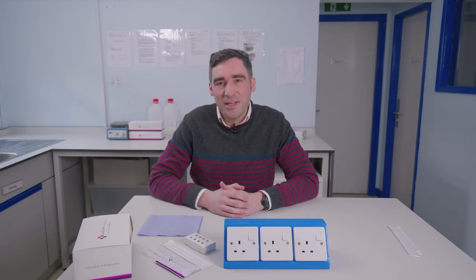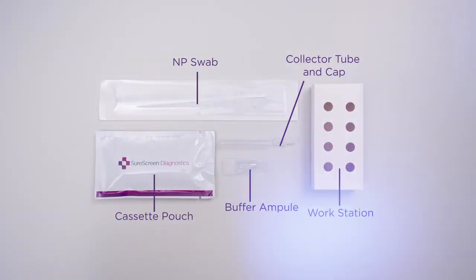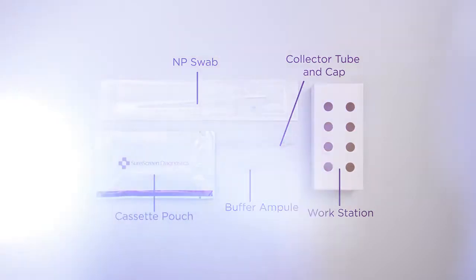In this video we're going to talk through the SureScreen COVID-19 antigen test. This test comprises a cassette and a swab that's added to a buffer to run the sample through the test, and we're taking a sample from each nostril. It's known as an anterior nares test, so it's really easy to conduct and it will give you the result within 10 minutes.